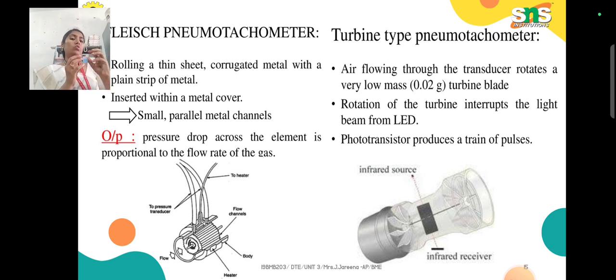The basic principle involved here is the usage of an LED light and a phototransistor. This is an important component that plays a very big role here. The LED keeps emitting light during the experiment. When the person is blows, the turbine rotates, and at the same time the infrared LED light emits light.